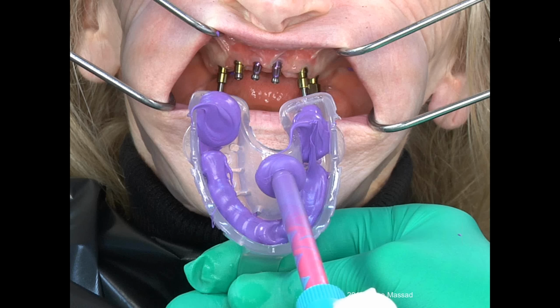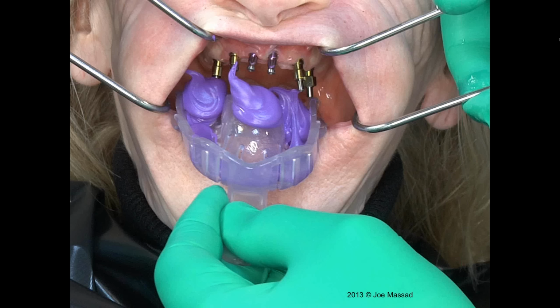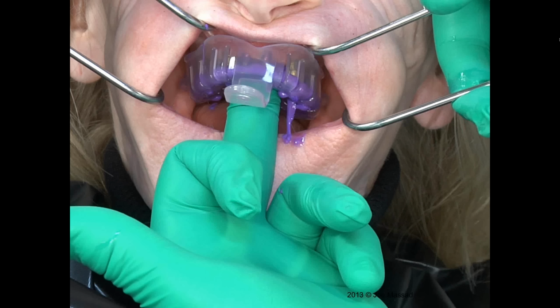One of the problems we have when we make impressions is that we move before the material polymerizes, or we rotate our hand a little bit, or the assistant takes over and we get slump. Slump is where your hand goes down, the material stretches a little bit, it's like it's beginning to drip internally, and you may go back up, but you can't really retrieve slump in most cases. Now I'm going to place this into the mouth, and this material in the mouth is 1.5 minutes, which is good. You want something fast. The longer you hold your hand, the more fatigued we get. And then as I take it out, I want you to analyze.